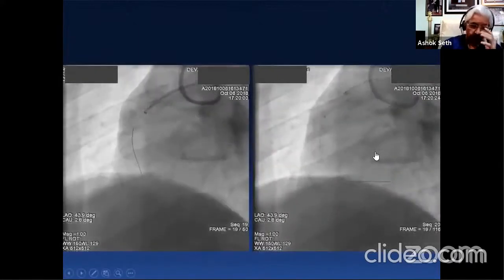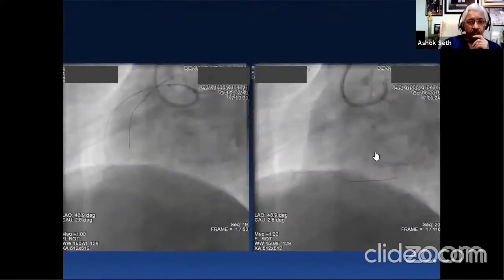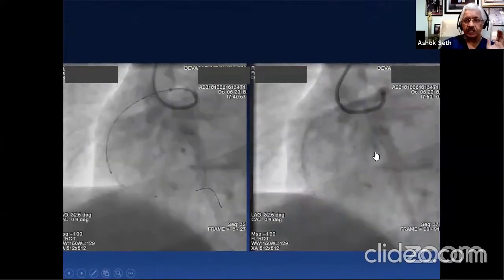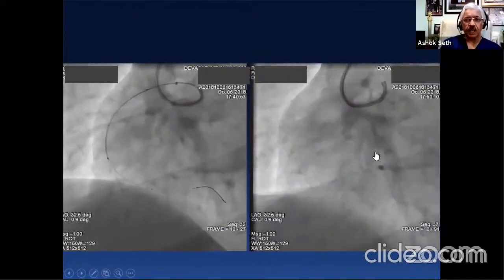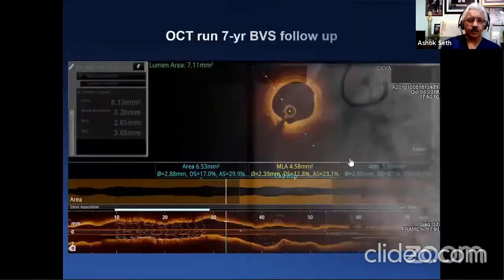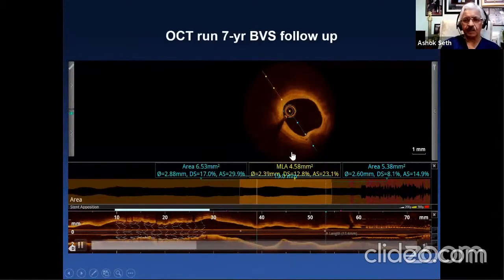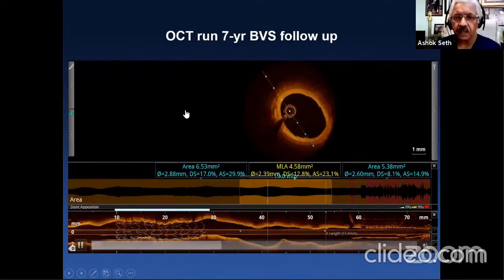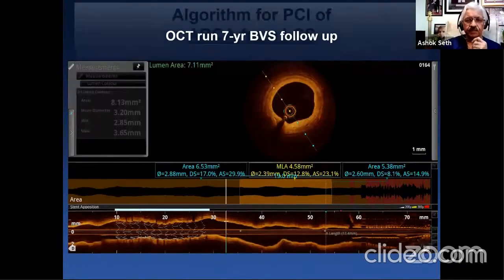And after that, of course, open that vessel up, stent that lesion, do an OCT analysis of that lesion, stent implantation, as well as the proximal segment, which had an Absorb 7 years ago. And lo and behold, we had a great expansion. But look at this, great images of no stent in the segment, which had an Absorb, clean vessel, no blocks either, golden tube, as one would say, 7 years later in the proximal segment.